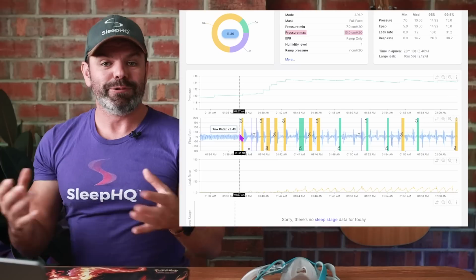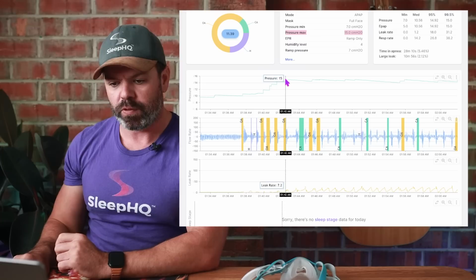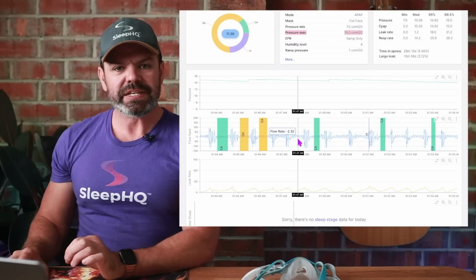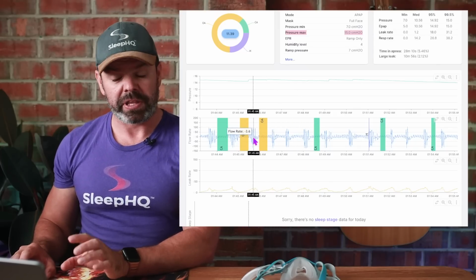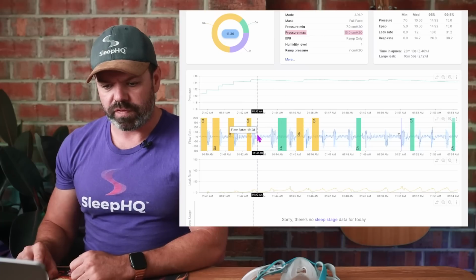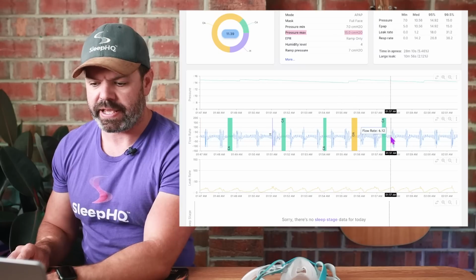All right, so it's the same pattern repeating. We have these yellow obstructive apnea flags, pressure stepping up like before, up here to 15. But this time, have a look at this. I'll just zoom in a bit more. Can you see the difference here? Can you see how the flags aren't accurately marked? We've got these green central apnea flags. They're not, they're obstructive apnea flags. We've got a flag missed here, missed here, missed here, missed here. We've got a lot of missed flags now.